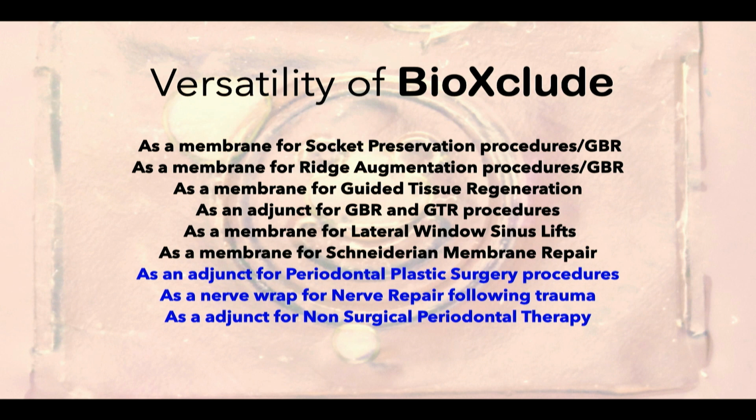I mean, we don't expect any bone graft that's going to be above the crest to really turn into bone, but it tends to act almost like just a scaffold. But the trick, I think, is just making sure that you're packing bone into that buccal occlusal line angle. That's where we need the bone. And then try that internal to external suturing.